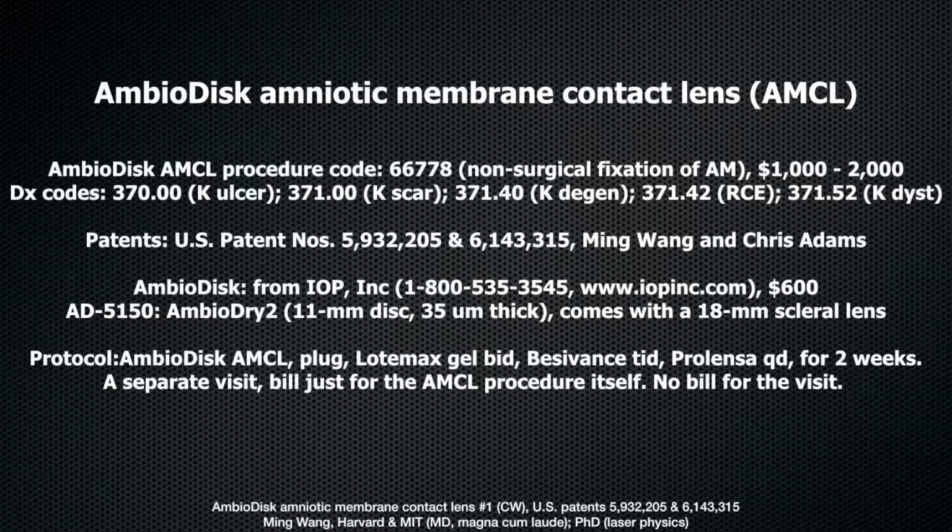And the clinical protocol of placing AmbioDisk and AMCL includes that we put bilateral lower collagen plugs, and after the AMCL is in the eye, Lotemax gel BID, Besivance 3 times a day, Prolensa once a day for 2 weeks. And then we have patient come back for a separate visit, and typically that is separate from the AMCL placement itself. And at that visit, typically we do not bill for the visit.